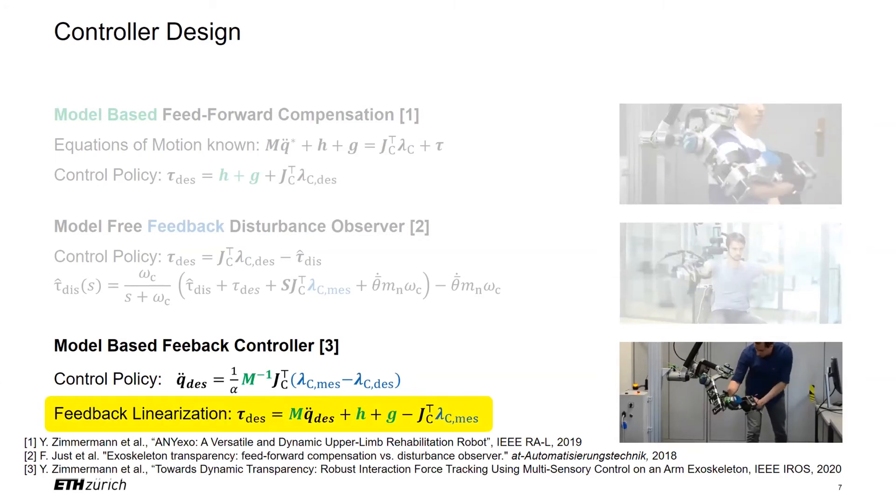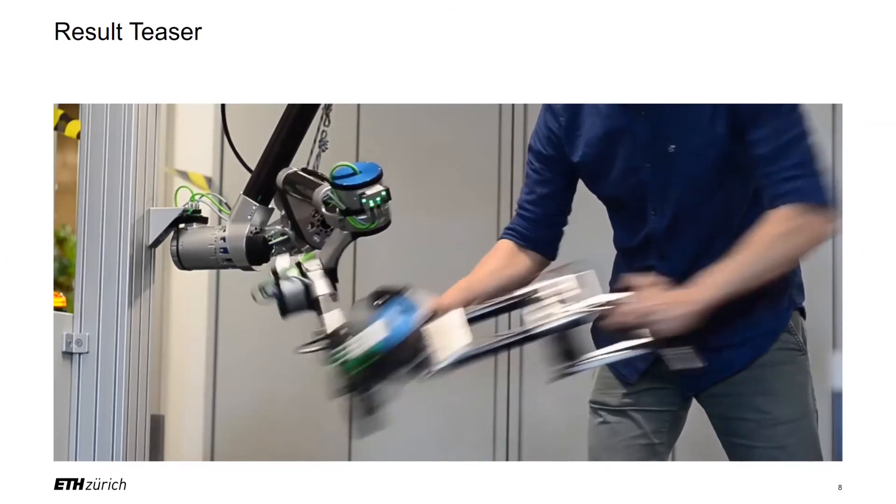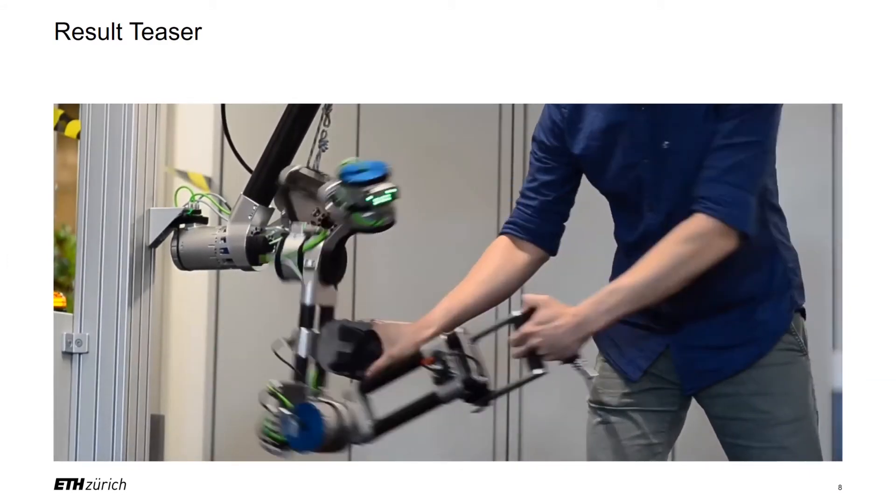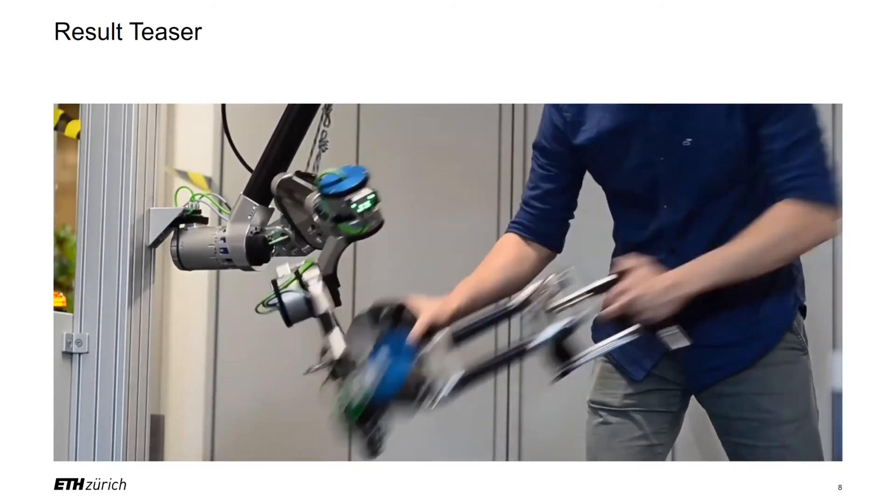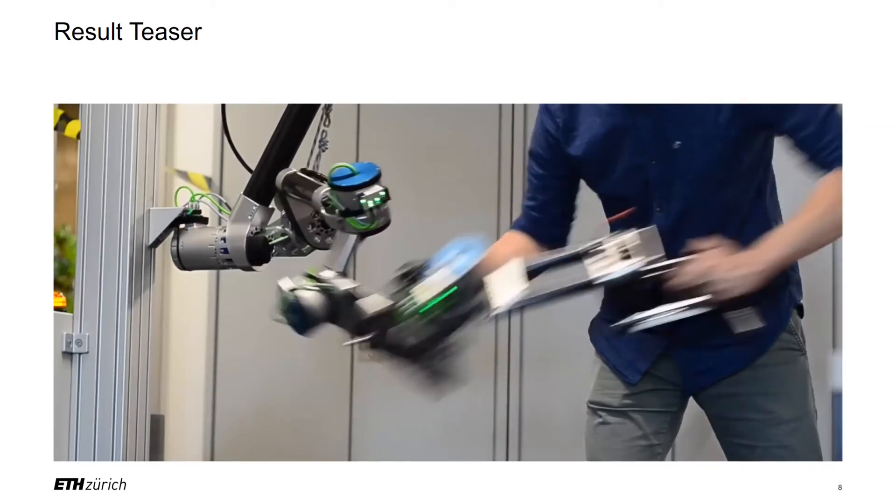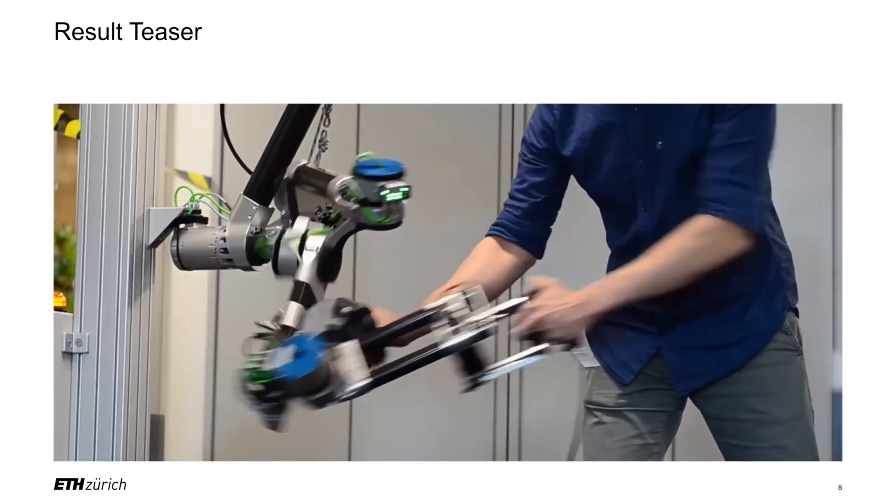First, we will have a look into the choice of the feedback linearization. Let's have a look at a video of the resulting controller. As you can see, there are large accelerations present in the excited movement, while barely any force is needed by the human to drive the robot. To make this possible, the environment that the robot interacts with, so here the human, has to be analyzed carefully.